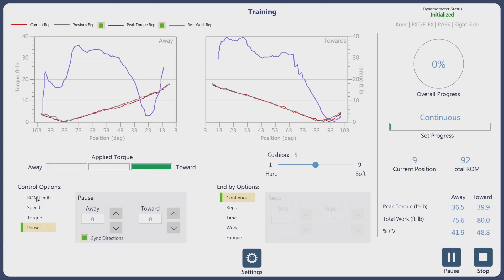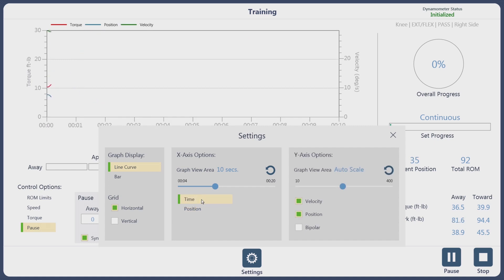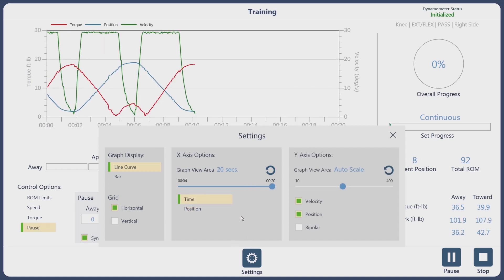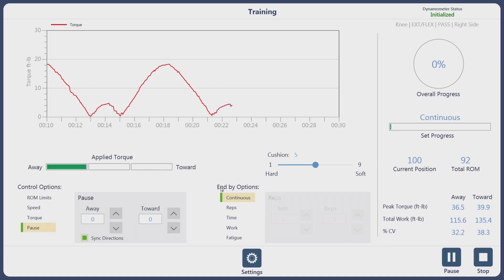We also have the ability to change from a position-based torque curve to a time-based torque curve. You have torque, range of motion, and velocity displayed, so you can take some of that information off the screen and just show them their torque curve.